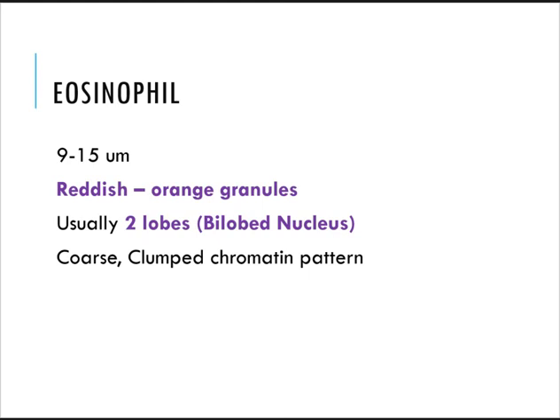Okay, next we have your eosinophil. So take note, guys, the difference is that its granules are very specific, and can be seen easily. Did you mistake it for anything? Charot. What I want you to take note is that it has 2 lobes.